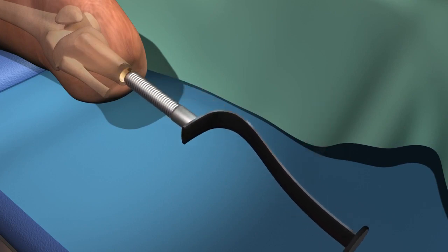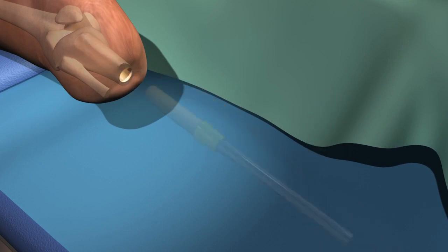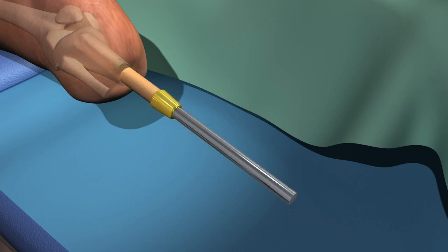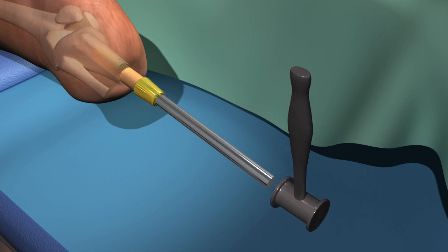The implant is porous coated and is impacted into position. Immediate stability is achieved.